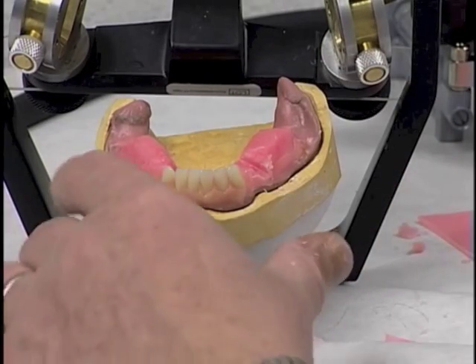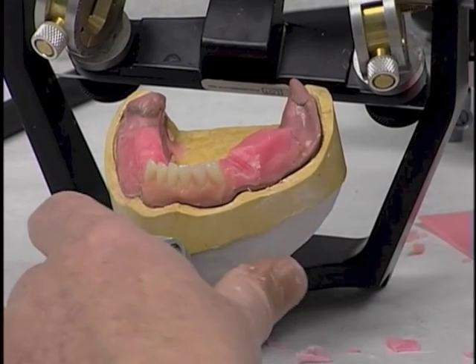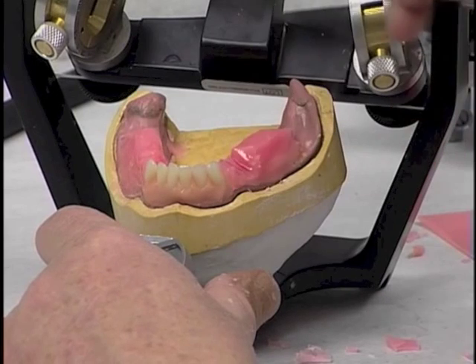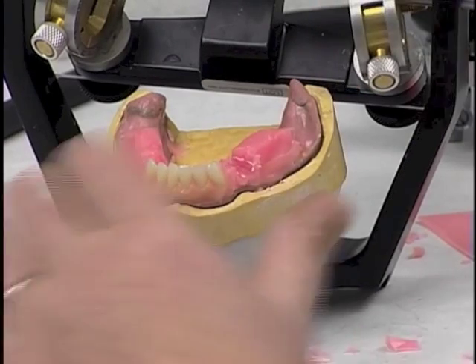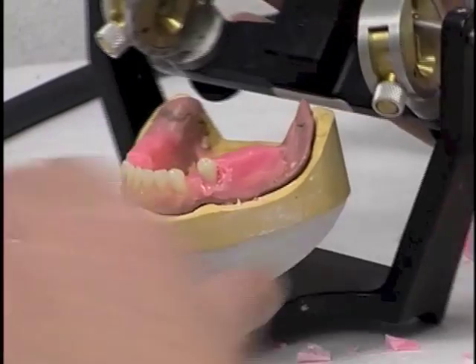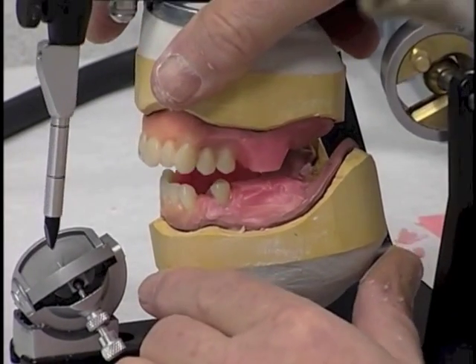We're going to attempt to arrange that mandibular second premolar in such a way that it articulates in centric relation with the maxillary two premolars that have already been arranged. Start preliminarily putting the mandibular second premolar in place.